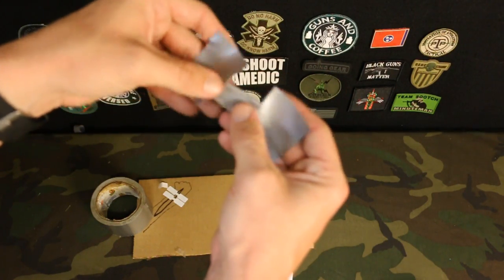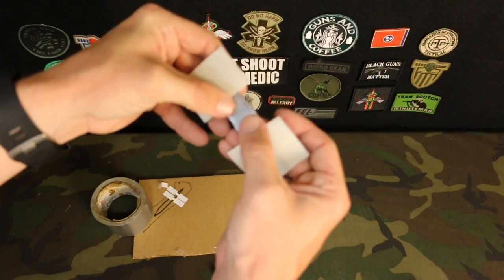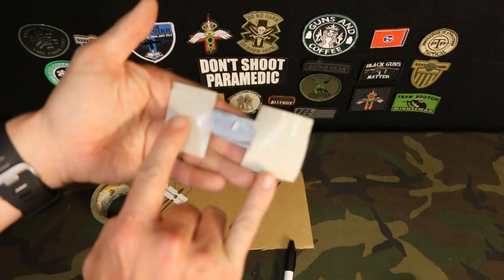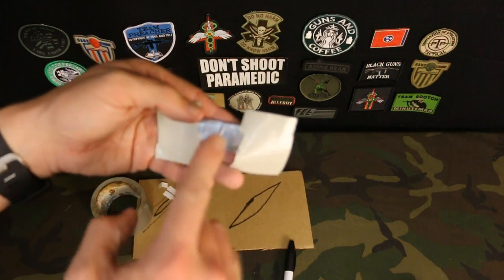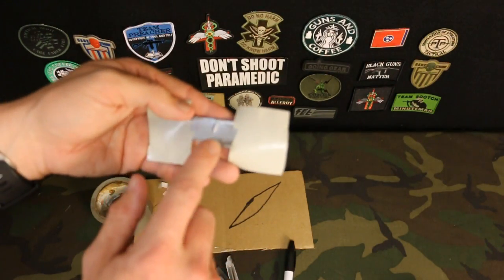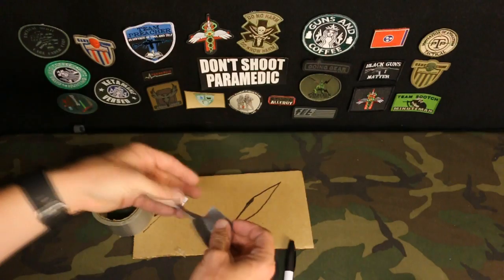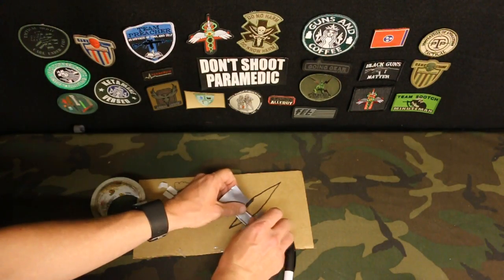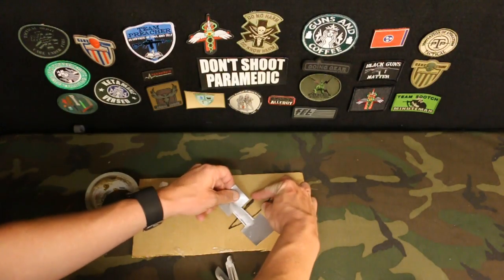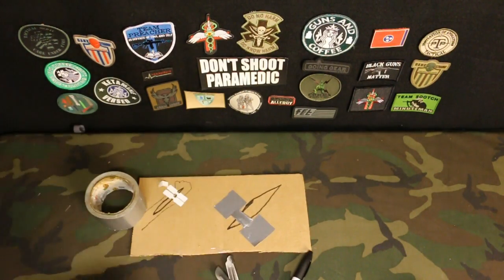And now I'm being really dramatic with the butterfly, obviously. But see, now this part's not going to be sticky. We want these two ends to be sticky because this is what's going to stick to the other side of our gash. But here we don't want this to be sticky because this is just going to be over the wound. And if this is sticky, this is going to just keep reopening the wound. So we apply it here. Get it nice and tight over there. You can start trying to close the wound up. Pull this tight. And that goes on.